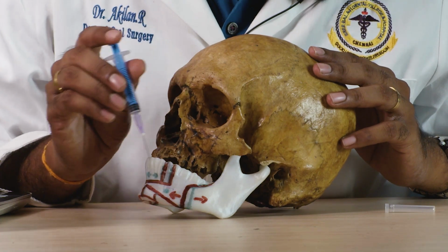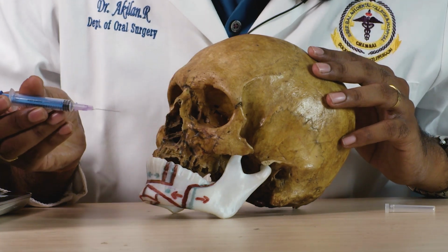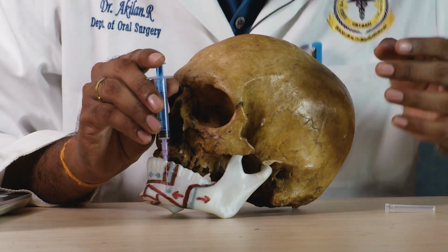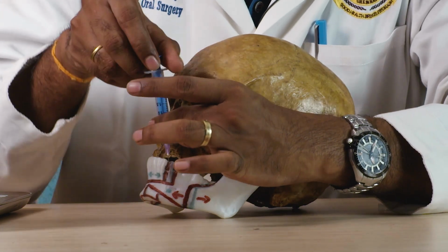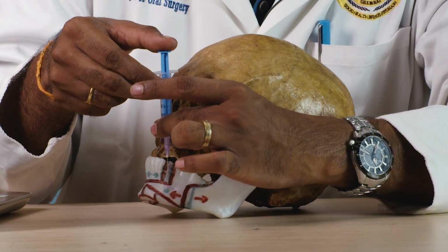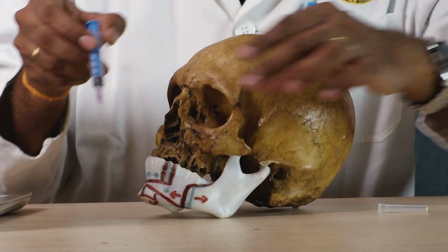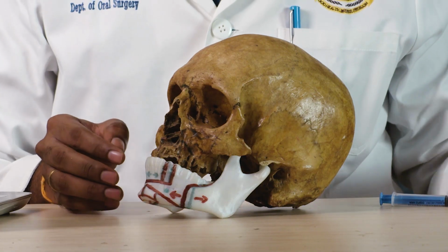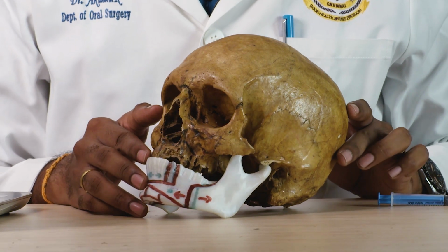Taking our syringe and needle held parallel with bevel facing towards the bone, we have to reach near the mental foramen. Once reaching the mental foramen, aspirate it, once it is negative, slowly inject about 0.6 to 0.9 ml of solution over 30 to 60 seconds.